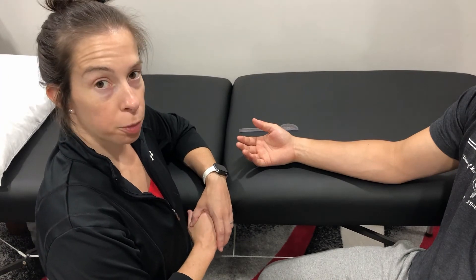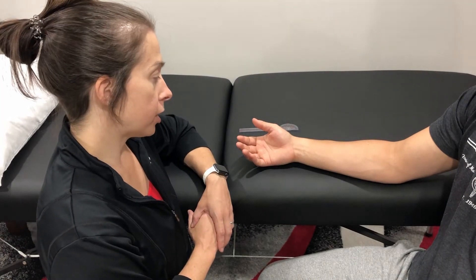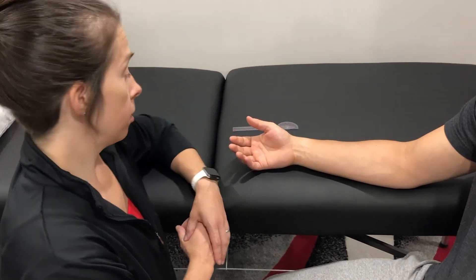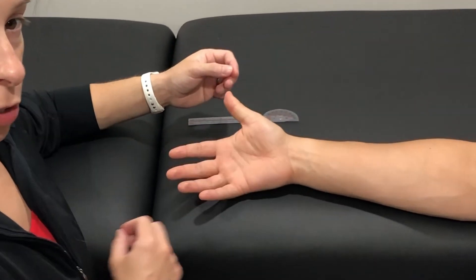Measuring thumb metacarpophalangeal flexion. The patient is sitting with the arm and hand supported in supination. We'll check passive range of motion first.